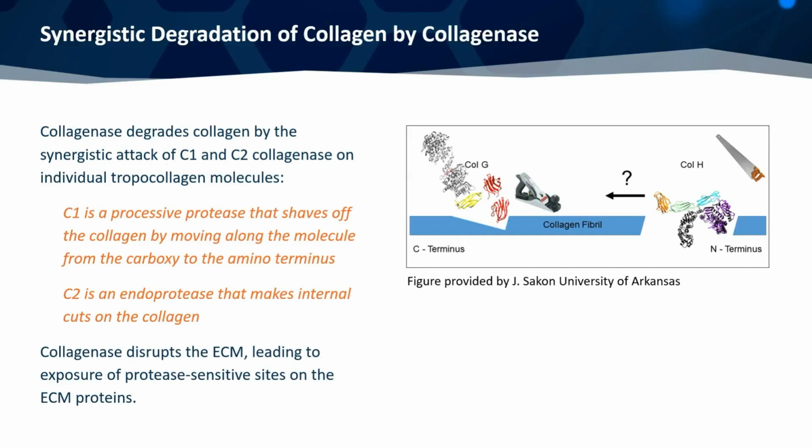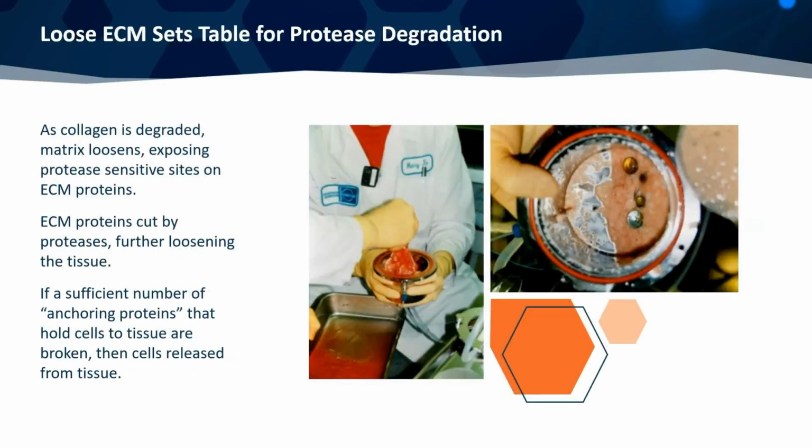But what it really is doing is it's now loosening up that matrix and freeing protease sensitive, or exposing protease sensitive sites on the ECM proteins. And here is just some slides from the Liberase HI product, where we're putting a porcine pancreas into a Ricordi chamber.